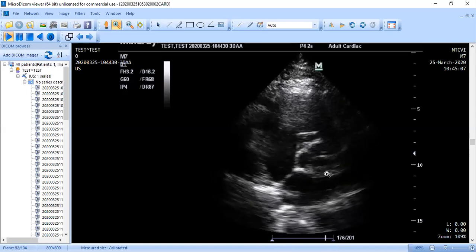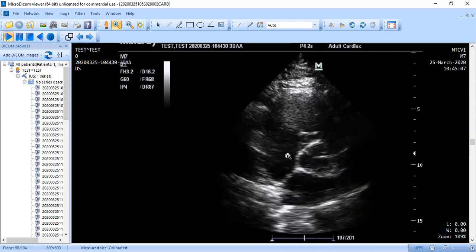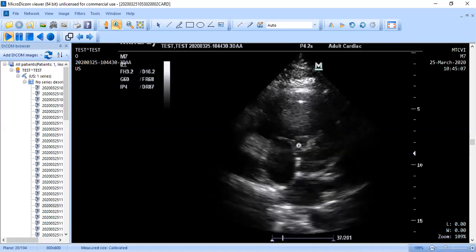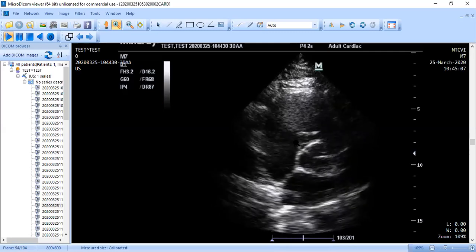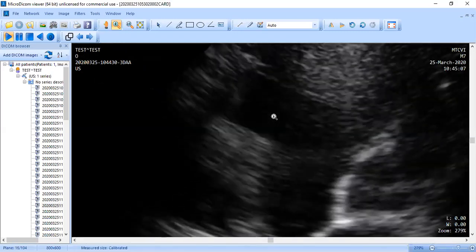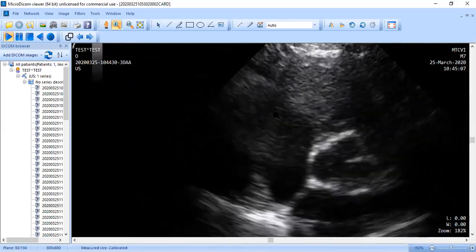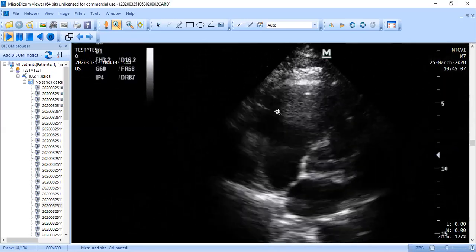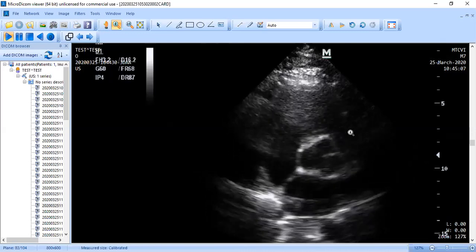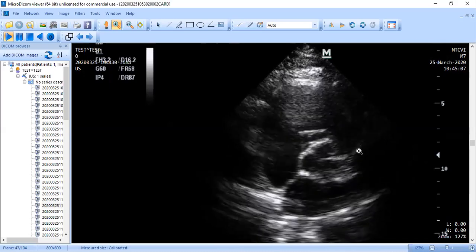All right, so we have our left atrium here, interatrial septum, right atrium, tricuspid valve. This is our medial, or it's also called our septal leaflet, and this is our anterior leaflet. Okay, the right ventricle. Sorry about that, zoom back out of that. The right ventricle is wrapping around this way. Okay, can't see it well here, but our pulmonic valve is right in this area here. Pulmonary artery is coming down this way.